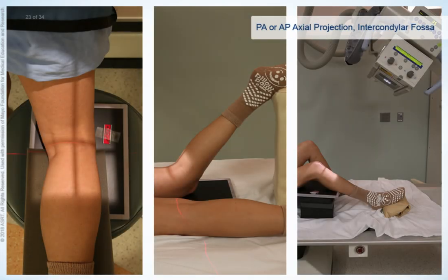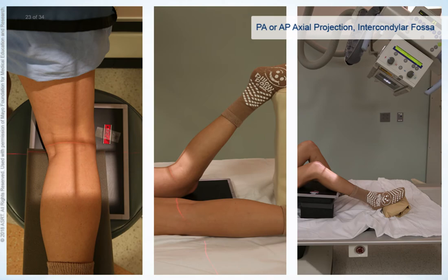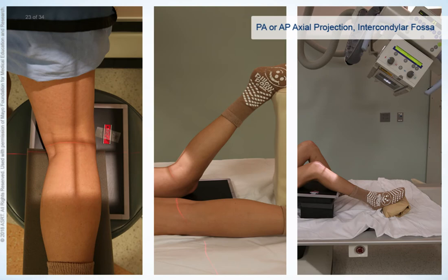Several methods can be used to perform an axial or tunnel projection of the intercondylar fossa with varying patient positions and central ray angulations. These include the Holmblad, Camp Coventry, and Beclair methods. The method used generally depends on departmental protocol, position preference, and the patient's condition.